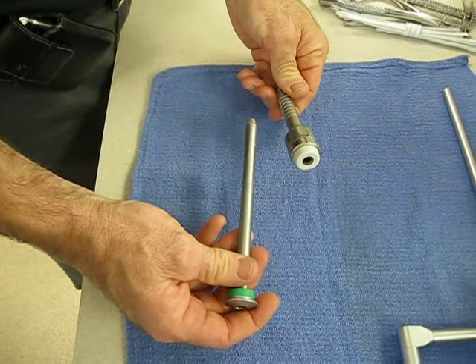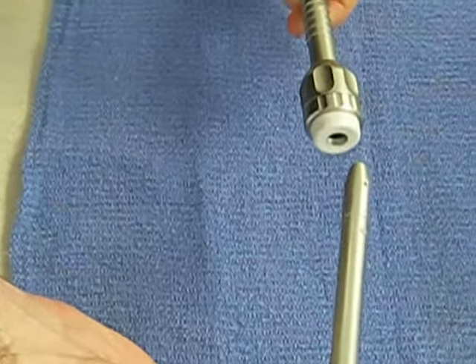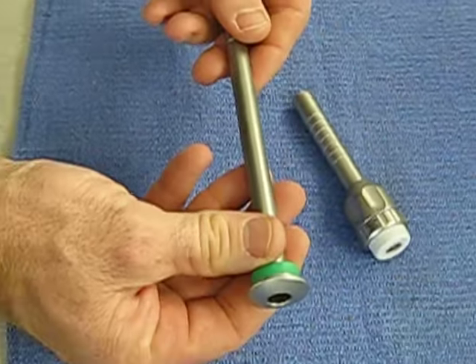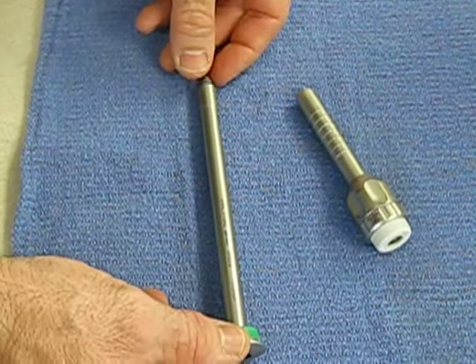To properly clean the trocar cannula, you want to remove the trocar from the cannula. This cleans separately and you can actually soak the entire thing in enzymatic cleaner.